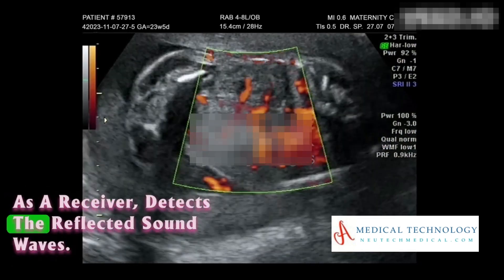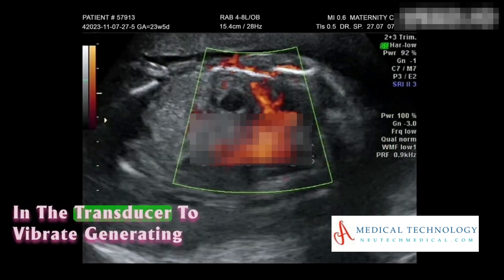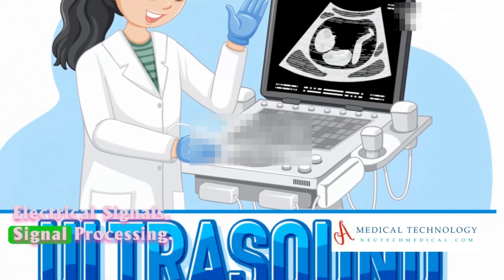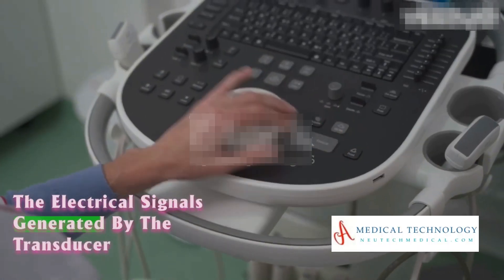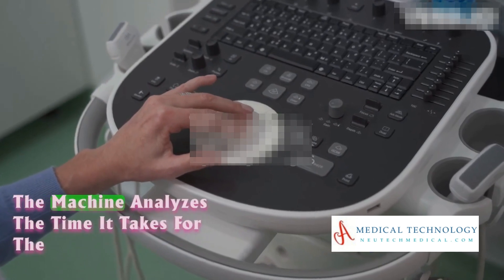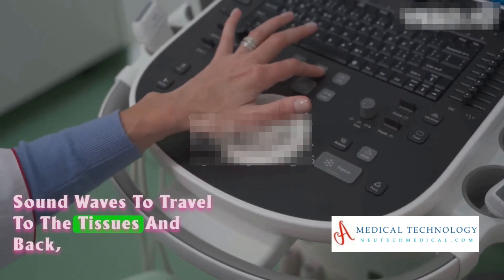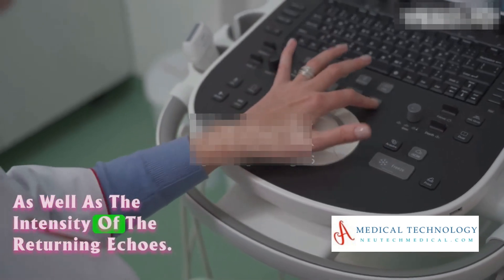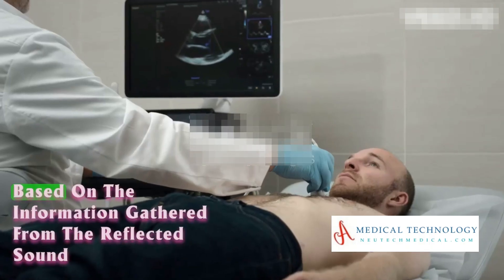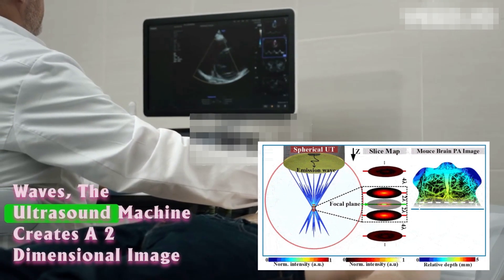The transducer, which also acts as a receiver, detects the reflected sound waves. The returning waves cause the crystals in the transducer to vibrate, generating electrical signals. These electrical signals are then processed by the ultrasound machine, which analyzes the time it takes for the sound waves to travel to the tissues and back, as well as the intensity of the returning echoes.